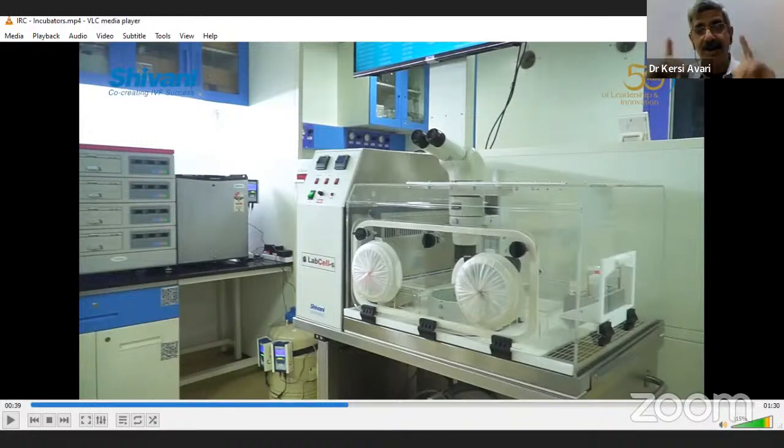Because remember, all cryo samples have to be immersed in liquid nitrogen, not in the vapors. That's why every canister on the top has a marking which is known as the frost line. Though the vapors also have a fantastic power of cooling, even at minus 90 or even at minus 120, there is a slight movement of molecules intra and extracellular.